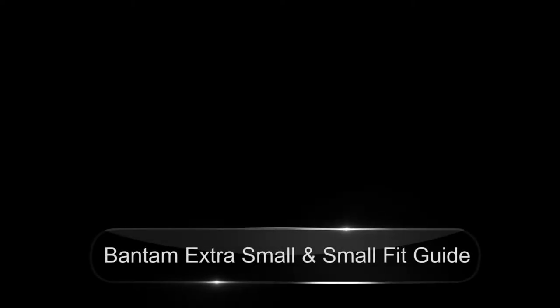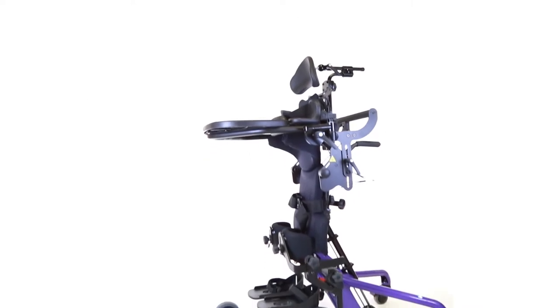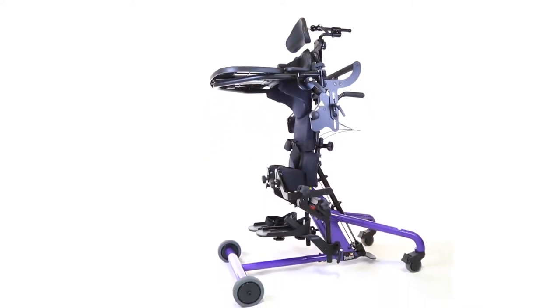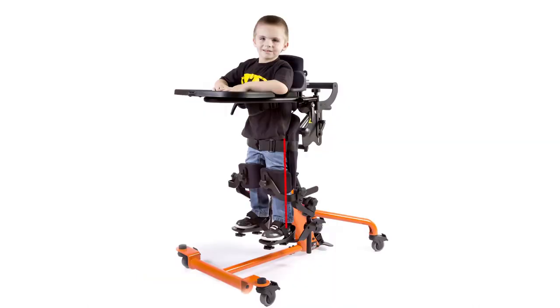So you just got your Bantam Extra Small or your Bantam Small, and now it's time to adjust it. When adjusted properly, the Easy Stand Bantam feels more natural to the child, and the hip pivot of the stander is aligned with the child's hip, reducing shear. Proper setup also ensures full extension at the hip and knee.